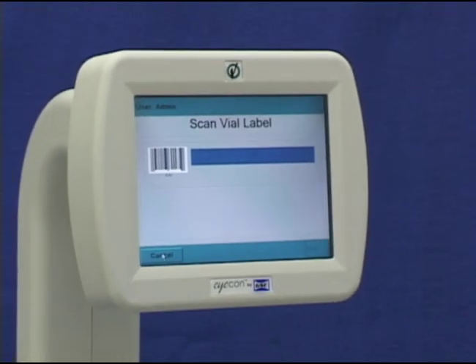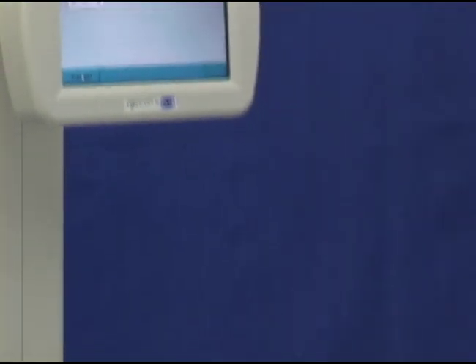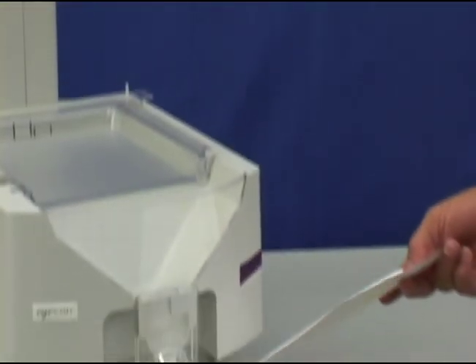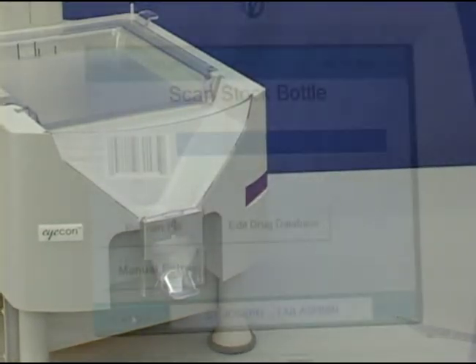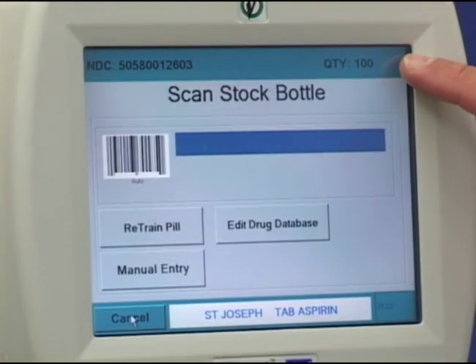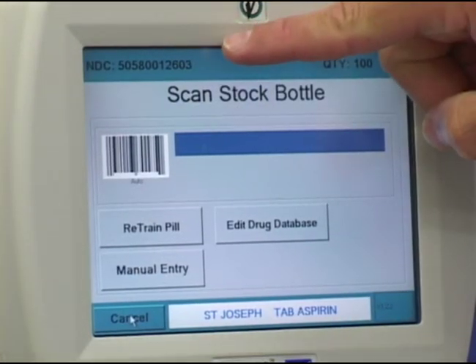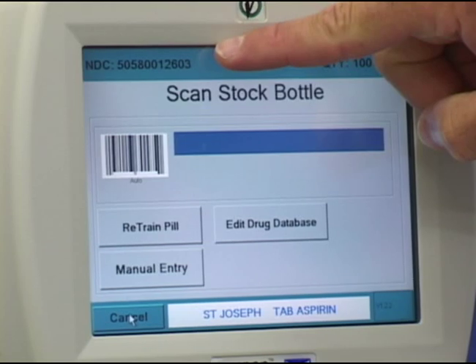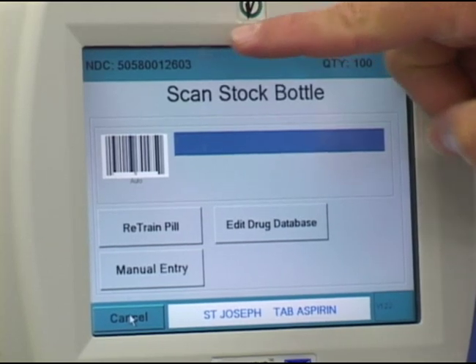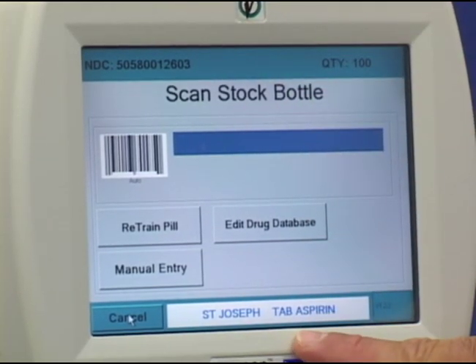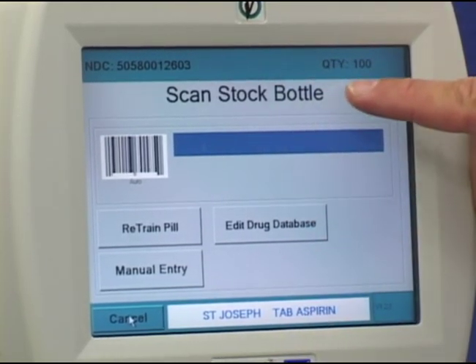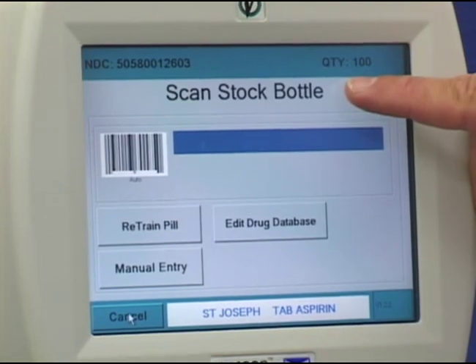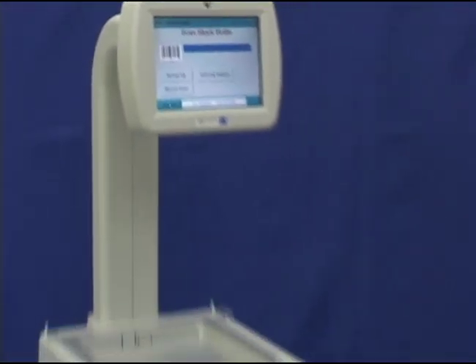The display prompts you to scan the vial label. Scan the vial barcode label and the display shows you the quantity required for the script, the NDC number, the pill name, and prompts you to scan the stock bottle for this script.